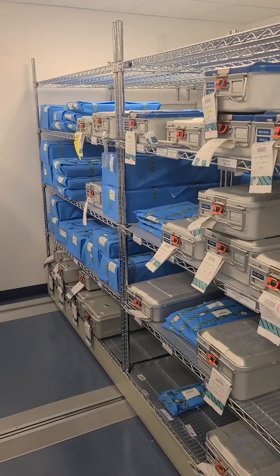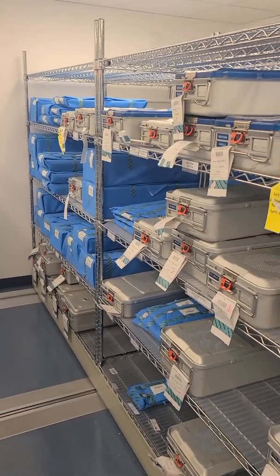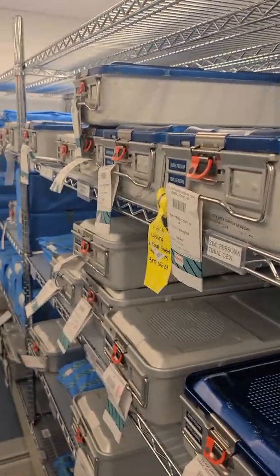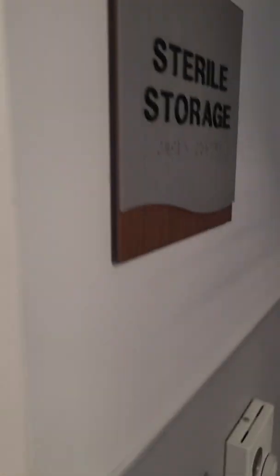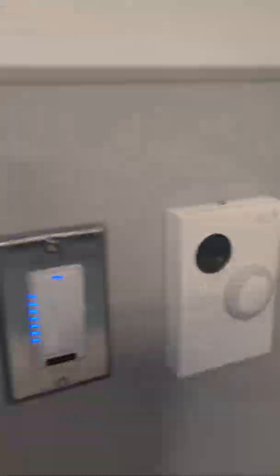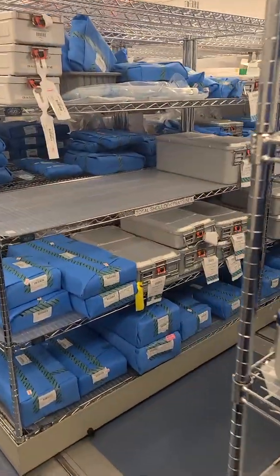Temperature ranges usually between 72 and 78 degrees is the optimal storage temperature — though at one point that specific range was a guideline, it no longer is. This room is actually at 71.5 degrees right now.